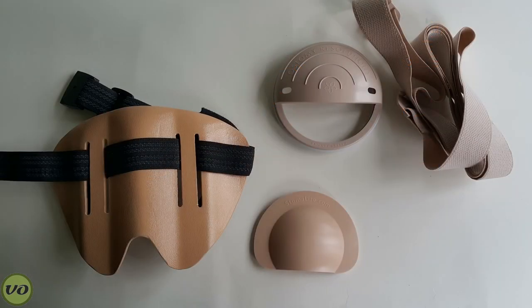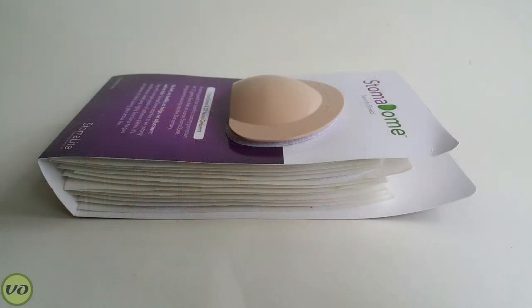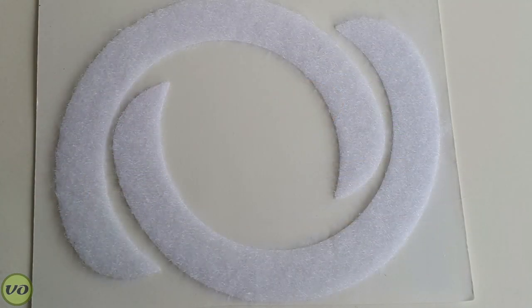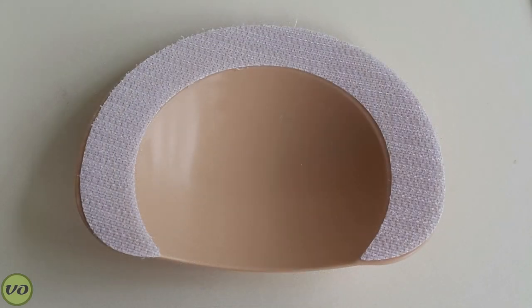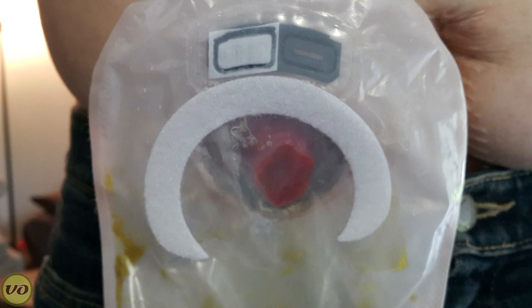You'll also note that it doesn't have any bands or accessory belts. In order to get the Stoma Dome actually onto you, you do have to apply these stickers — they're basically velcro crescents that go onto your pouch — and then you attach the Stoma Dome on top of that. This has some positives and negatives to it.